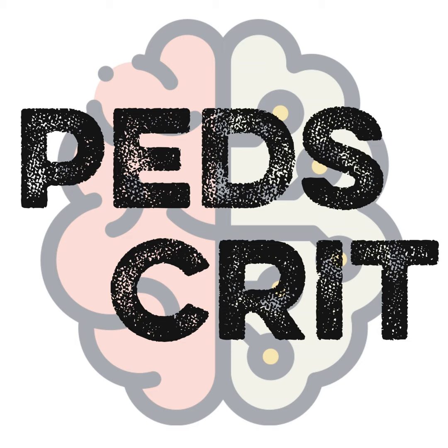So that's why I think in older kids, if we can avoid the neck cannulation, which is an essential part of your circle of Willis, every effort is made to preserve the cerebral blood vessels. Right, for that risk of stroke, the most important thing we're trying to do is preserve that brain. Exactly. Yes. So we've got our 15-year-old with myocarditis cannulated via IJ-FEM.